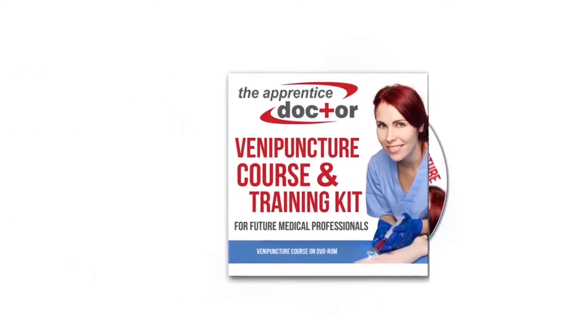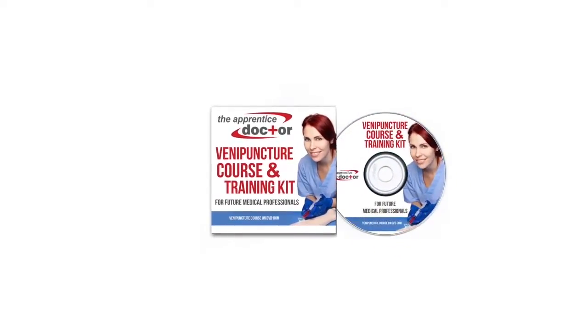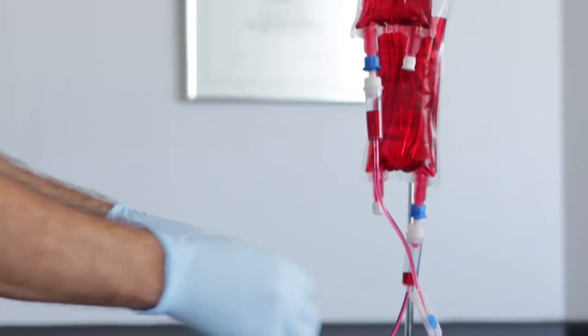The Apprentice Doctor Venipuncture Course DVD-ROM, containing interactive multimedia course. The Venipuncture Trainer, which allows the student to practice the various phlebotomy, IV, and related skills.